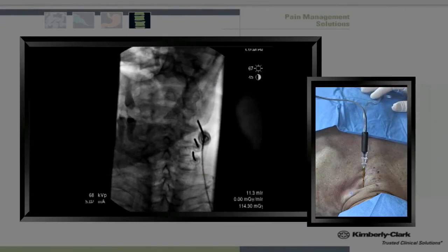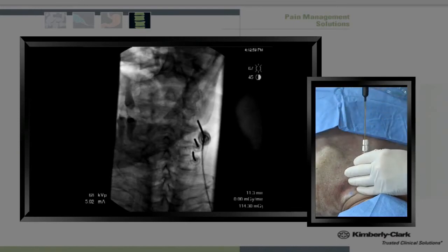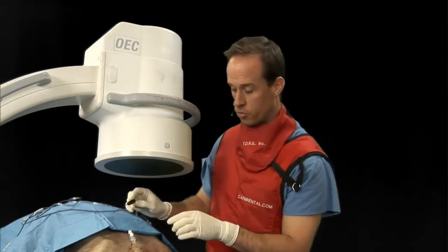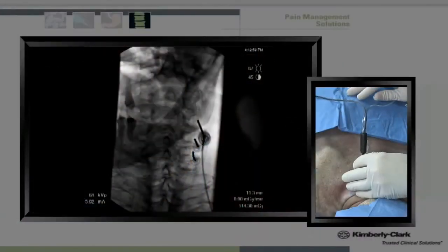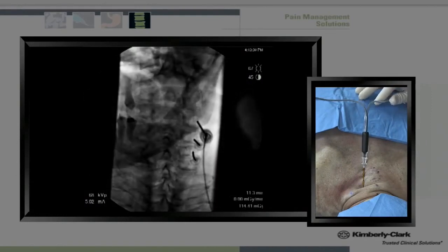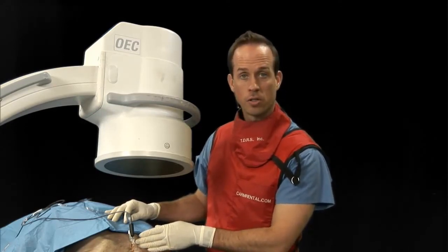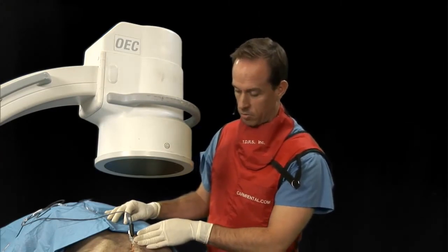I do motor testing at 2 hertz and 2 volts, always making sure we do not have upper extremity motor stimulation. Without stimulation, I place 1 cc of 2% lidocaine to try to prevent post-operative discomfort. I then reintroduce the probe, confirm on the lateral view that we have not moved, and go ahead and start our lesion at 60 degrees for 2 minutes and 30 seconds.